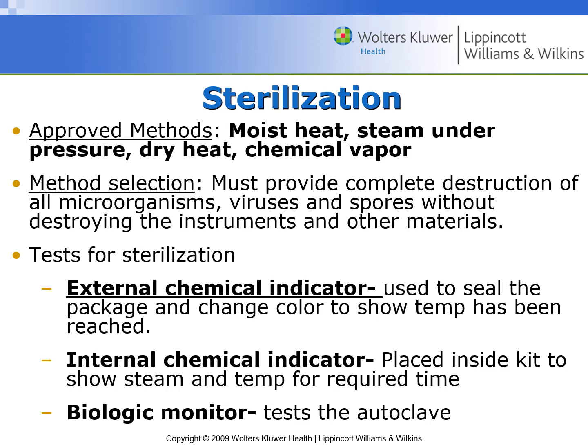So then once a week, the CRIS will come in and do a biologic monitor, which tests the autoclave. We won't have anything maybe in there, maybe it will be in there with a set of instruments, and she'll put in a biological monitor. This gets sent in to a company, and they come back and tell us that our autoclave is always running the way that it should be running and reaching the temperatures for the length of time that it should. So we have a lot of ways that we try to keep on top of the sterilization.